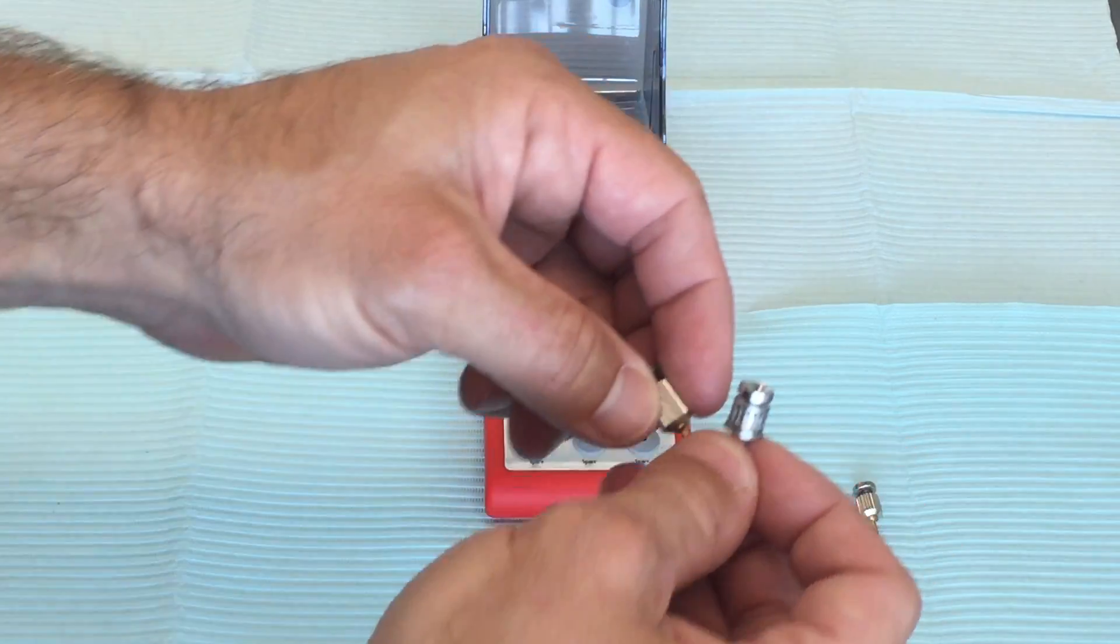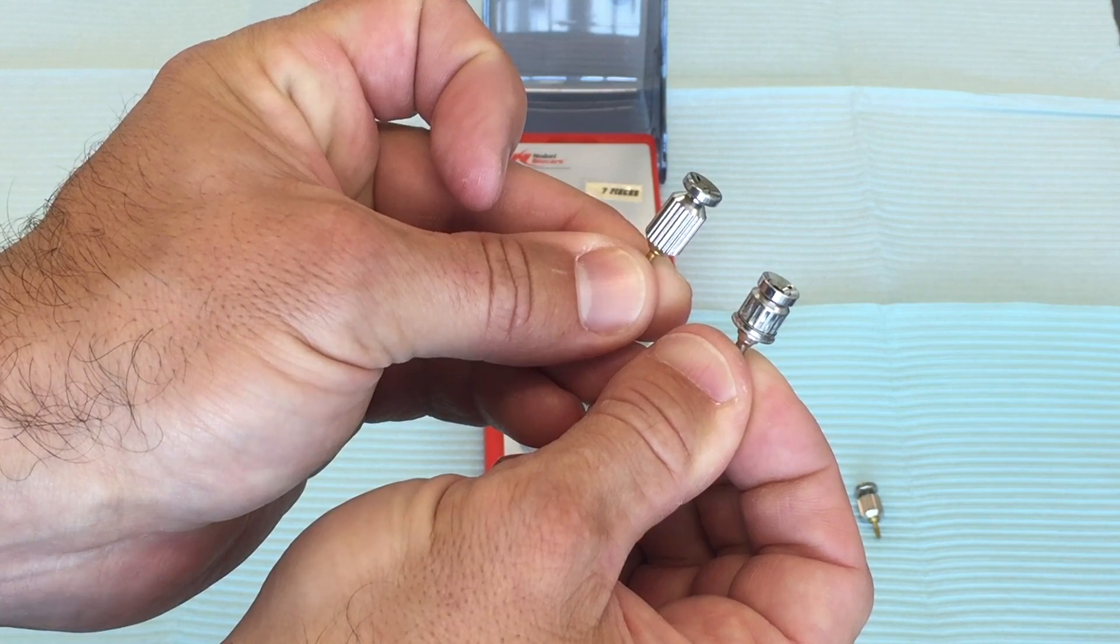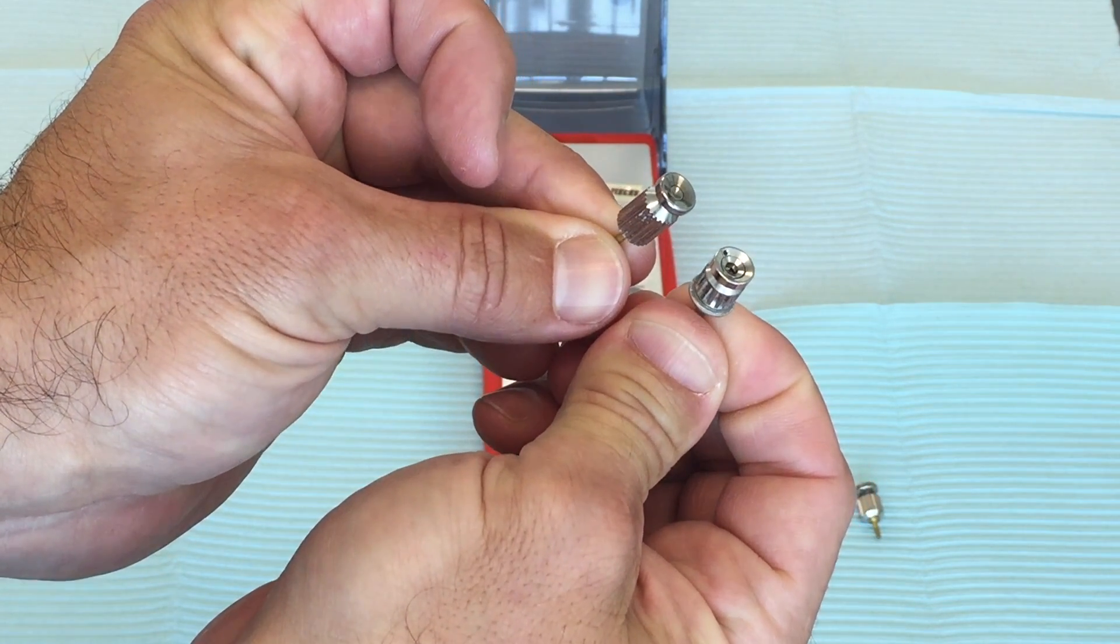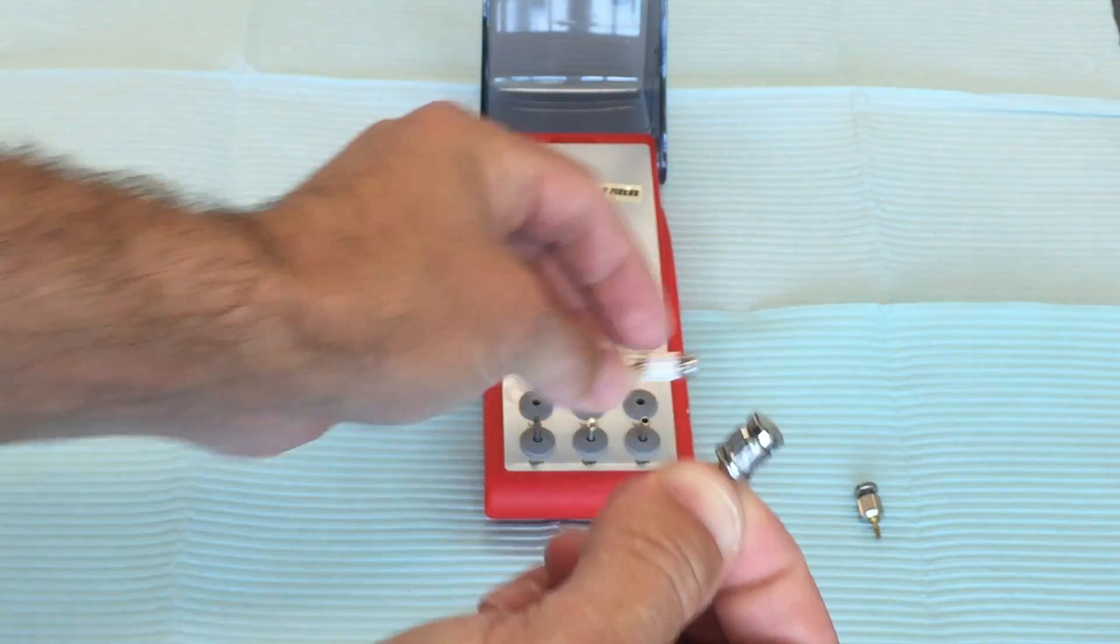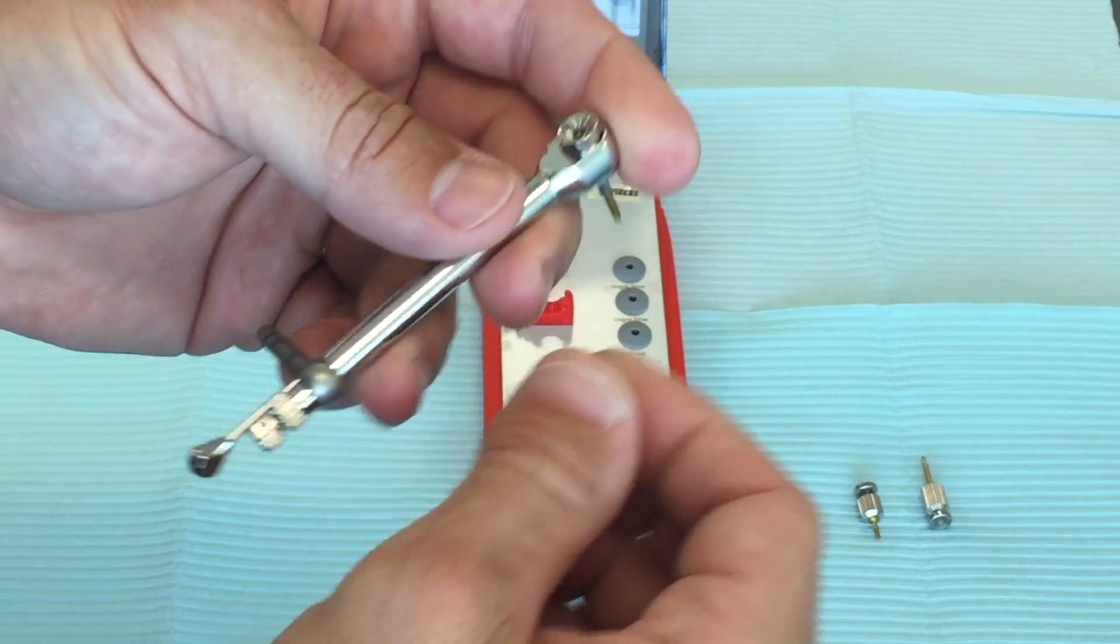The biggest thing to note when using the Nobel kit is paying attention to which driver you have. The one on the left just has a bunch of shallow fins on the handle, the one on the right has a bunch of deeper, wider grooves to it, and this is the only driver that will work with the torque wrench. If you try and use the other one, the torque wrench is just going to spin around the driver and you won't actually tighten anything.